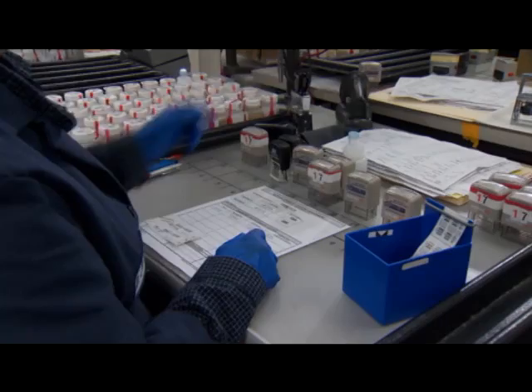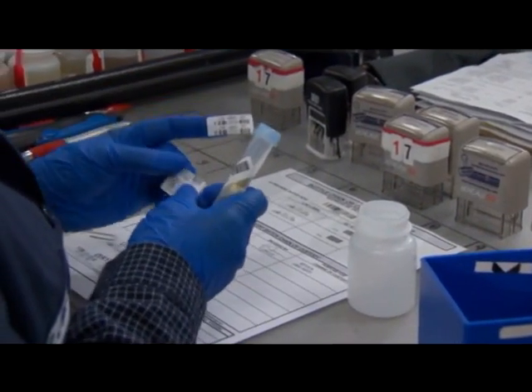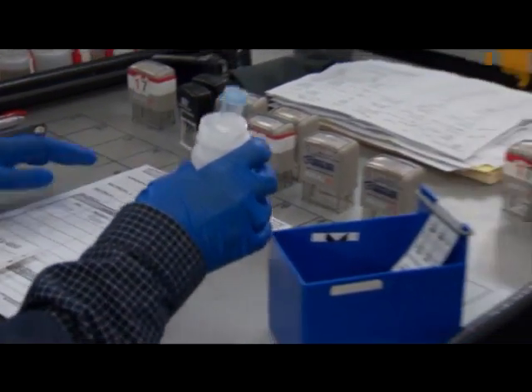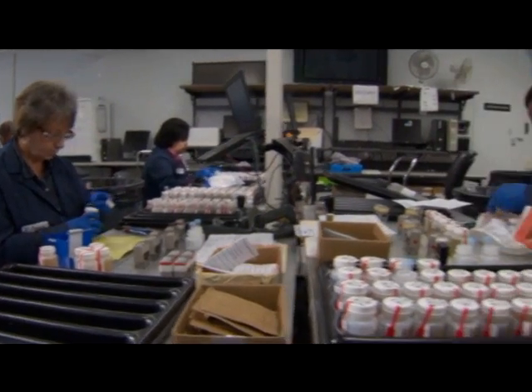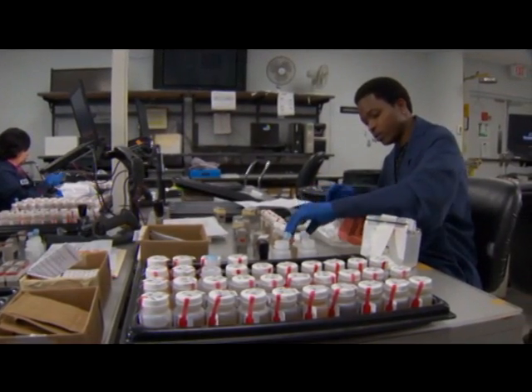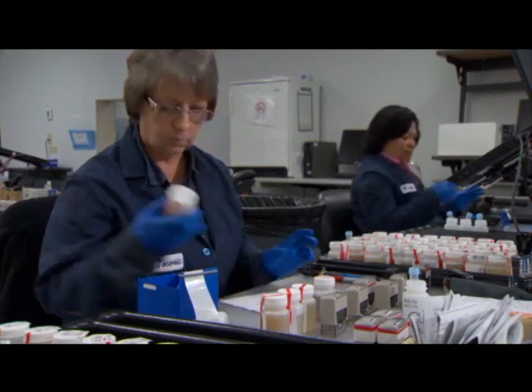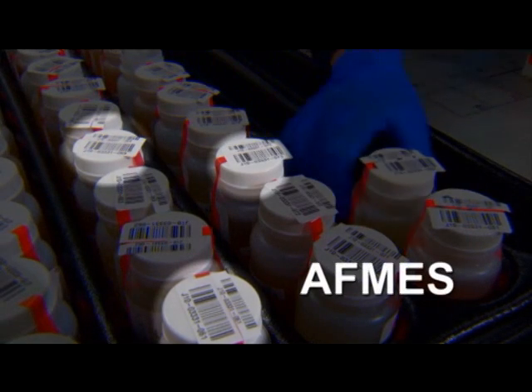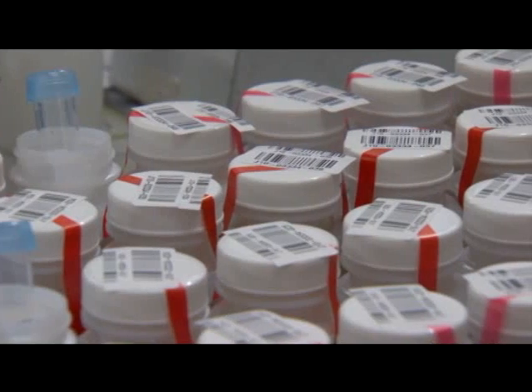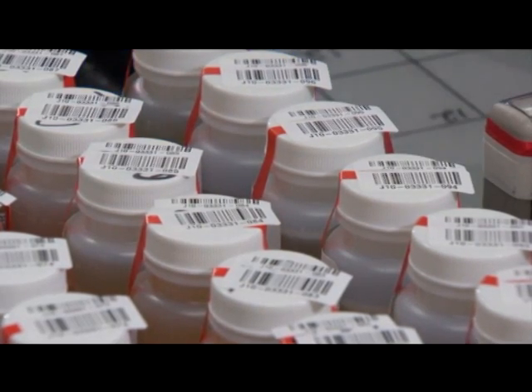This is also the point where internal blind quality controls are added to the mix. A blind is a urine sample that contains a known quantity of drugs. This is a critical quality control practice that assures both the equipment and lab personnel are properly identifying every potential positive sample. In addition to internal blinds, external blind quality controls, referred to as proficiency samples, are randomly shipped to the labs. Even though these samples appear to come from Navy or Marine Corps commands, they're actually sent by the Division of Forensic Toxicology, Armed Forces Medical Examiner System, as an external quality assurance measure. Accurate results for these external blinds are required from each lab in order to maintain DoD certification.